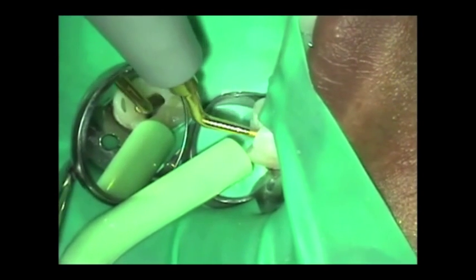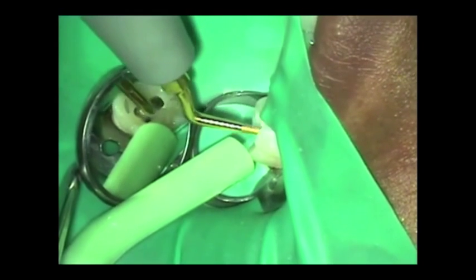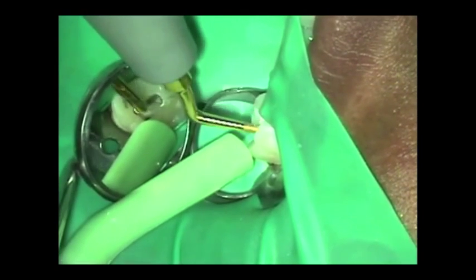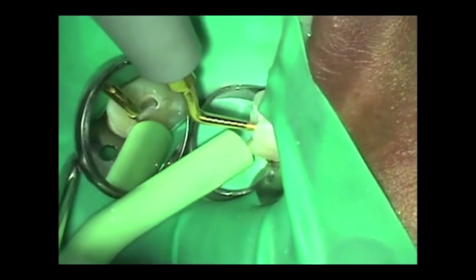I don't want to gouge the floor and I certainly don't want to perforate. So we exhaust our efforts to try to find it. And if we can find it, then we'll clean it. If we can't find it, we don't want to risk compromising the integrity of the tooth. We just want to run along that line there.